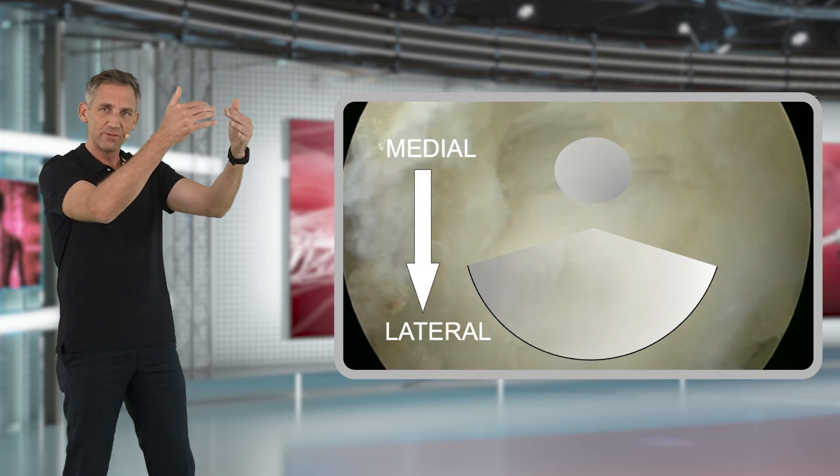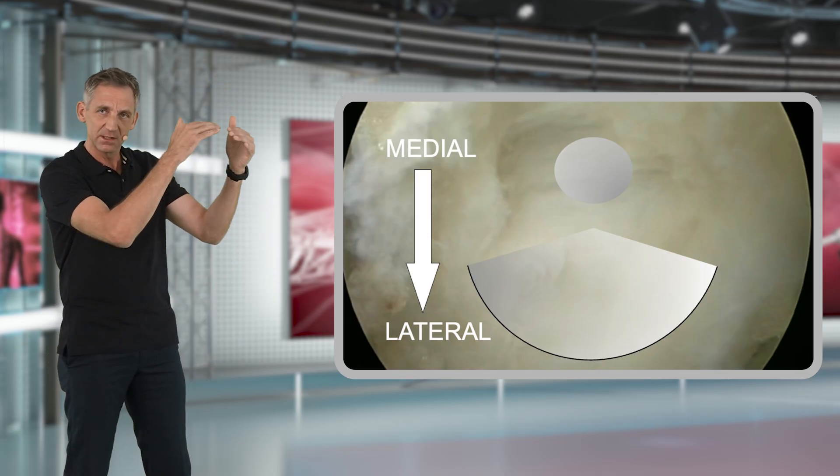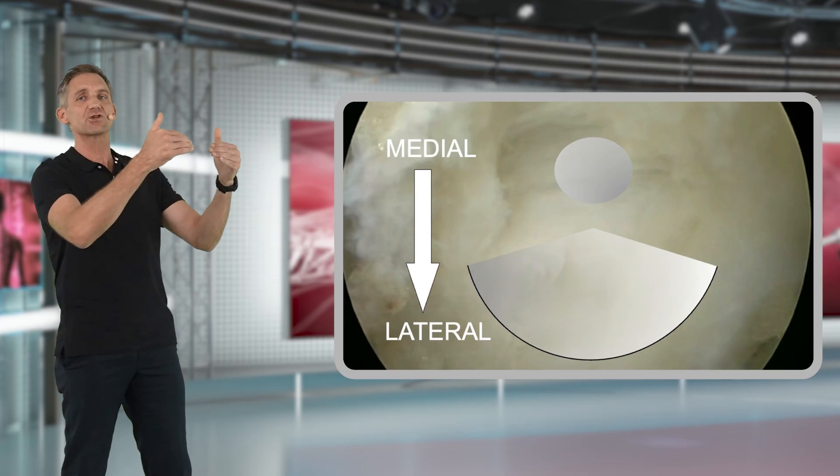Once you have entered medially, you can continue removing the yellow ligament layer by layer in the lateral direction.